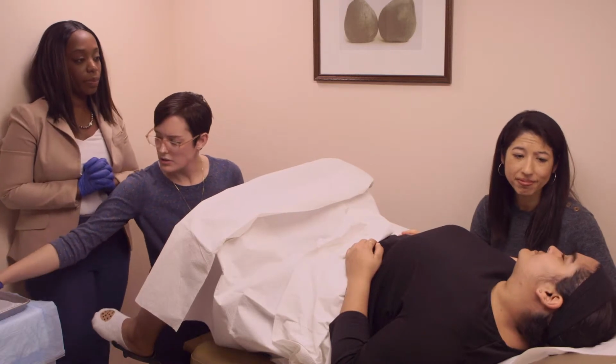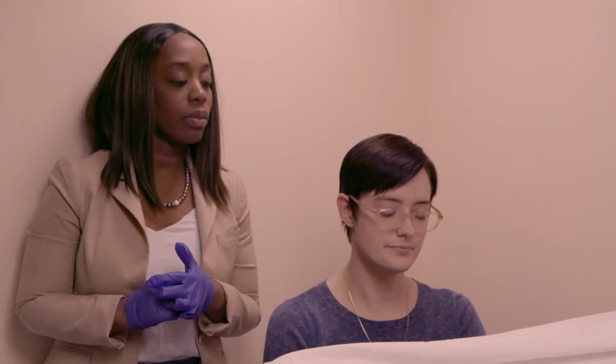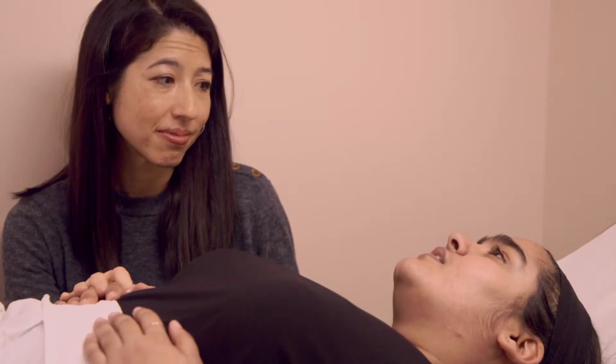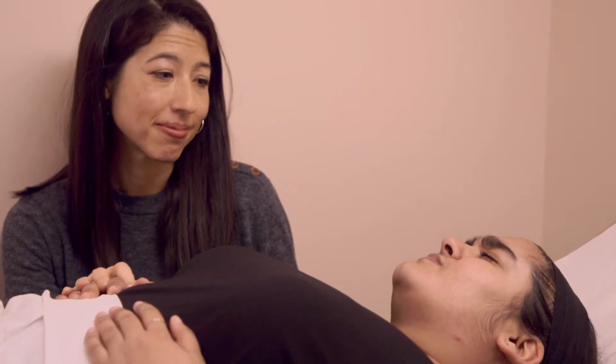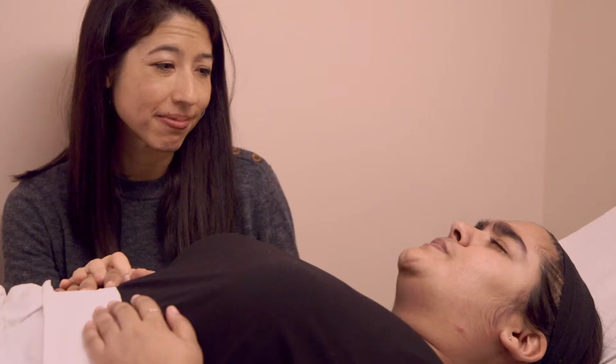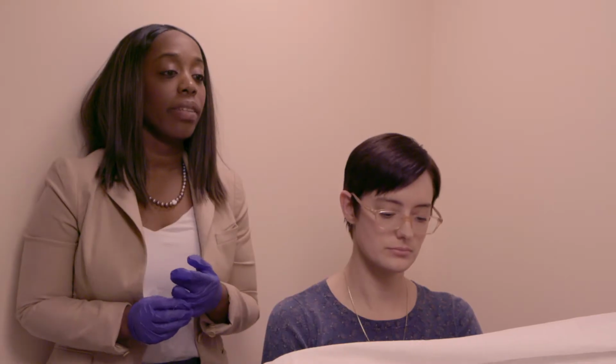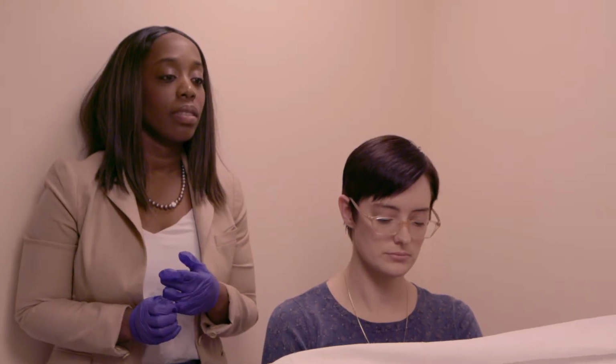Okay. So now I'm going to slowly stretch the cervix. You may or may not feel some cramping. Just let me know how you're doing. Just take some nice deep breaths in and out. How are you feeling? It's starting to get a little crampy. What you're feeling is normal. Would you like us to keep talking, or do you want us to be quiet? Let's keep talking. It's helpful.